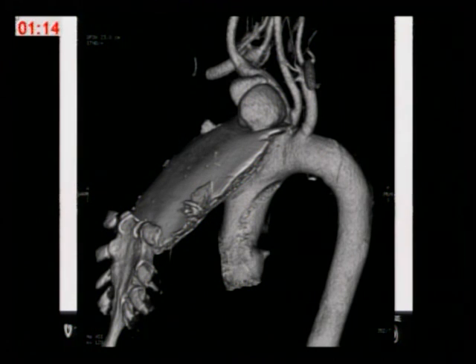This is a patient who had had previous radiation to the chest, debridement of the sternum for a tumor, replacement of the sternum with a methacrylate, and then had that erode back into the transverse aortic arch, creating a saccular aneurysm here. I would submit to you that for most of us this would be a very challenging open operation. And due to the left common carotid arising really at the base of the innominate artery, a carotid-carotid bypass in and of itself wasn't going to be enough.